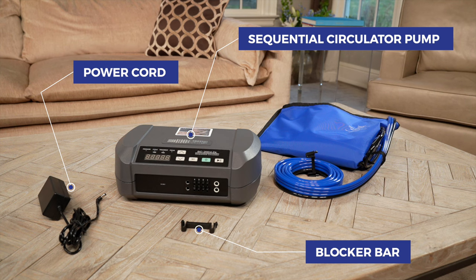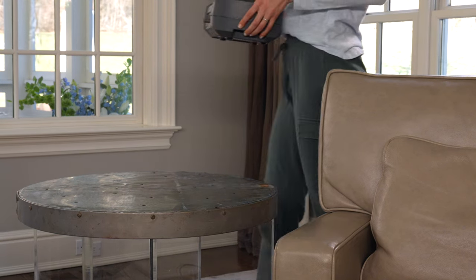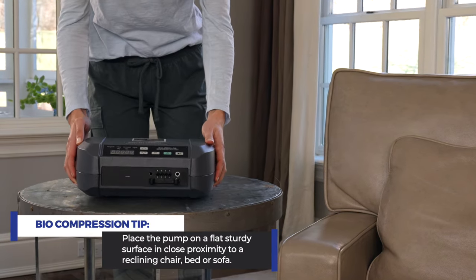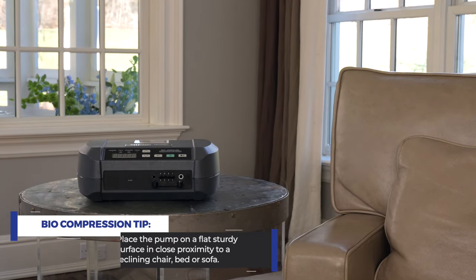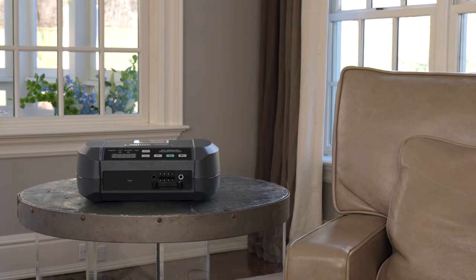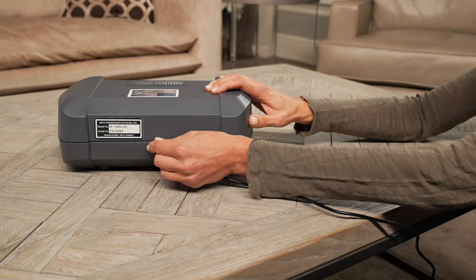Your garments may have been shipped separately and are necessary for operation and treatment. Choose a location to set up your pump. Place the pump on a flat, sturdy surface in close proximity to a reclining chair, bed, or sofa where you will be comfortable during treatment. Attach the power cord to the back of the pump and then plug it into an outlet.